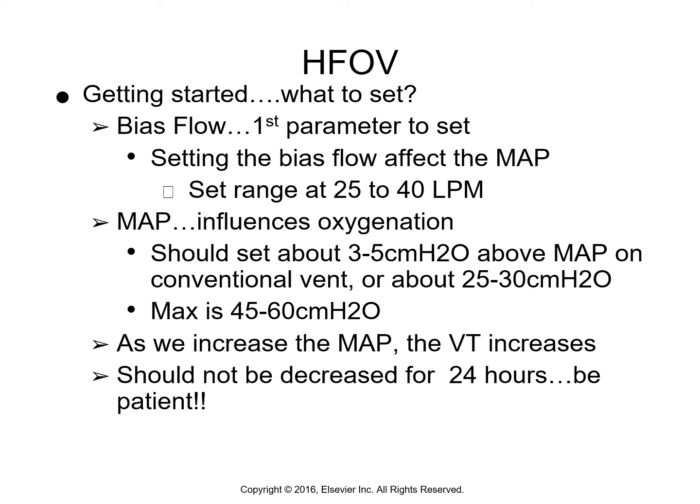Because a low flow may actually result in an increase in PaCO2, from not enough flow to wash out the exhaled gas. Also be careful that it's not too high either, because that can dampen the active exhalation, because there's another small diaphragm in the circuit, not the one in the piston, and Marty kind of shows us that when we go see it.